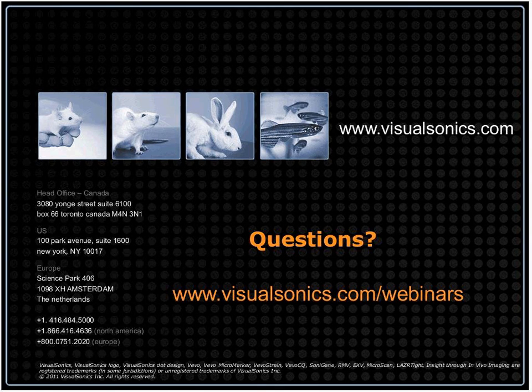There are lots of arguments for and against both for a variety of differences. So if you're thinking of designing an experiment to use nonlinear contrast, I encourage you to look into the different approaches that are out there. VevoCQ fundamentally doesn't really care which one you use, as long as you have a good image, and as long as you're confident in your injection or in the destruction reperfusion in the area that you're looking in, that it is reflective of the tissue that you want to look at.